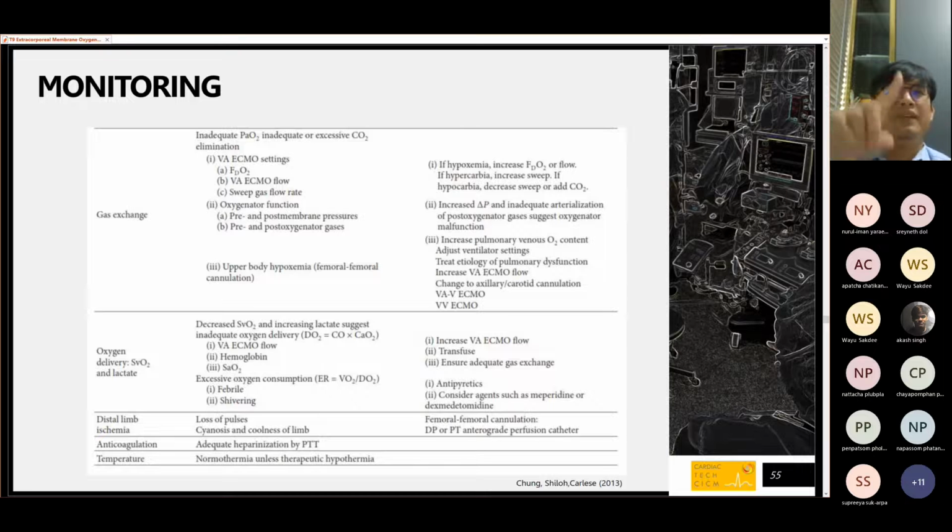So that can cause the ischemic event for the distal part of the limb. To prevent that, some people put another catheter to provide blood in two directions. I will show you later about that. Some people only observe. So how harmful is this condition, the loss of blood supply to the distal limb?